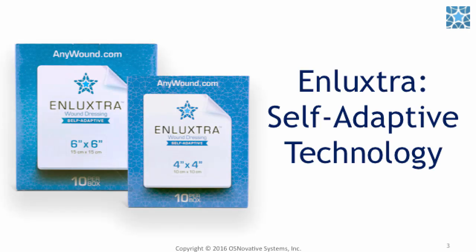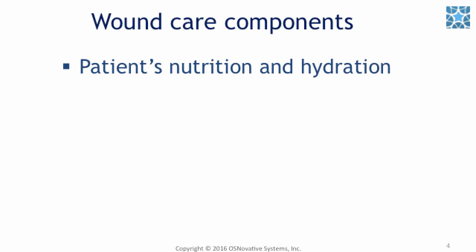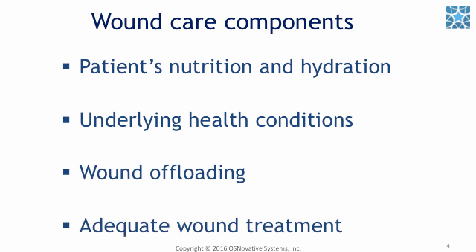Let's begin. Every wound care professional knows that the wound healing process involves several equally important components: the patient's proper nutrition and hydration, addressing underlying health conditions, wound offloading, and adequate wound treatment. Now, let's discuss wound treatment challenges.